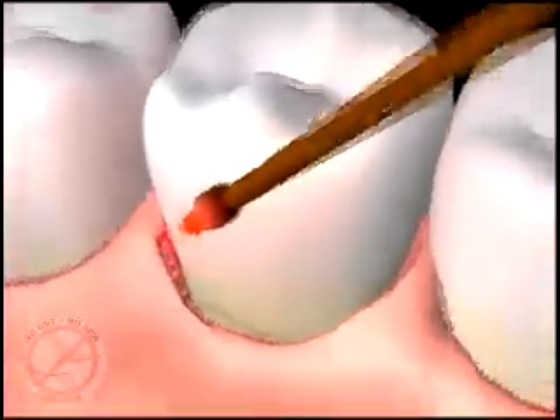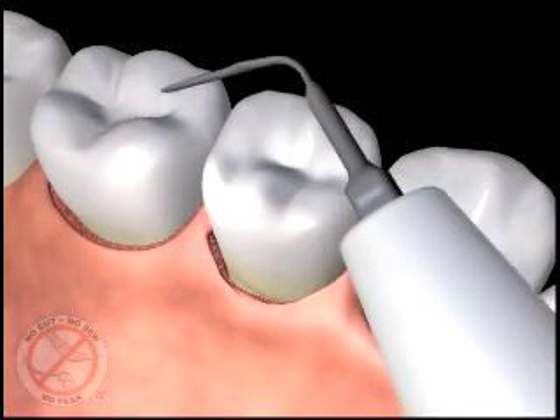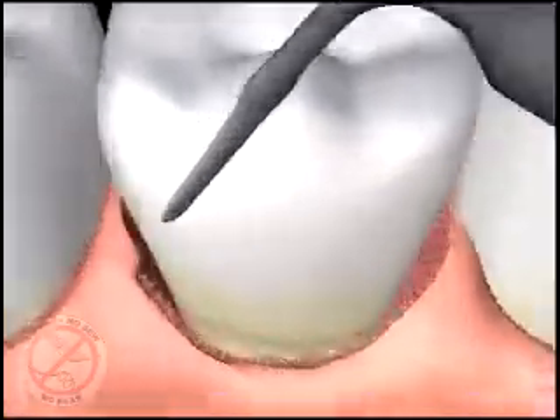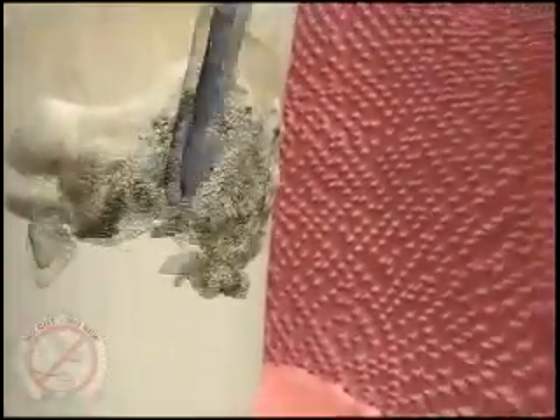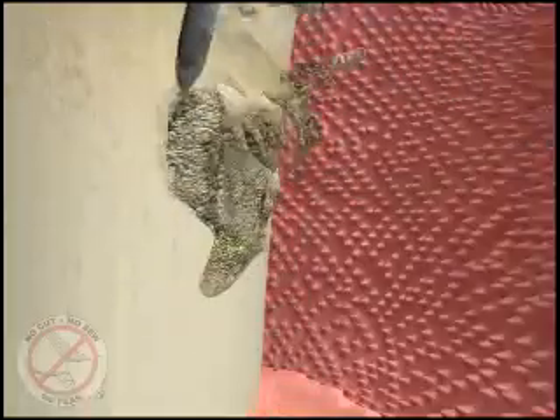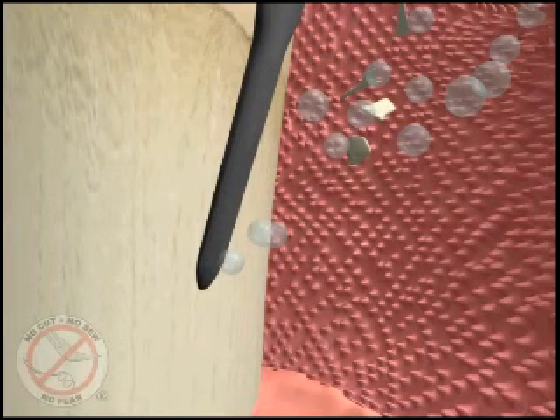The laser tip is then removed from the pocket and set aside. In the next step of the procedure, ultrasonic cleaners as small as a laser fiber tip are used to remove the hard deposits we call tartar or calculus from the top of the teeth and roots. These instruments use sound waves to vibrate and break apart the hard mineral calcium deposits, with water flushing away the debris and cooling the instrument tip. Some hand-cleaning instruments may be used at this time to remove any remaining hard calcium deposits.